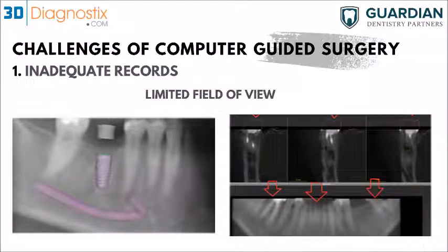So this would actually depend on the machine you're using. Some machines actually could provide you with choosing the field of view that you want to scan for that patient. If not, then if you have a machine that usually scans with a smaller field of view, the problem would be, first of all, we're not going to have the complete or the entire arch recorded. So that's going to be a problem because, as mentioned before, it's really important to have the intraoral scan matched with all the dentition on the scan from one side to the other. The other problem will be not being able to record the occlusal anatomy, which we actually use to merge those scans together.